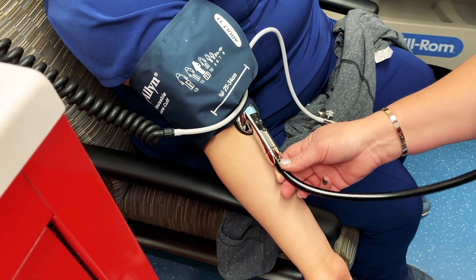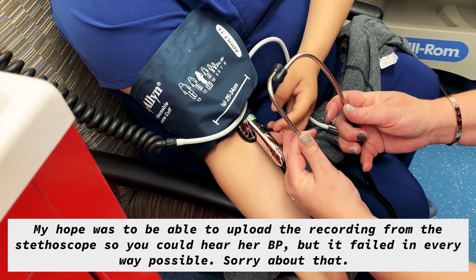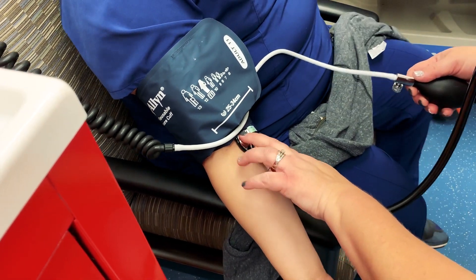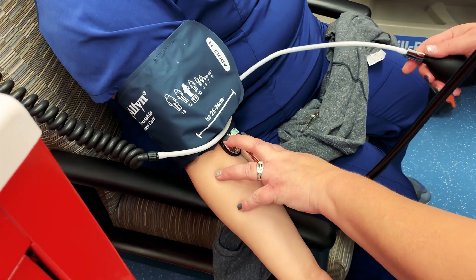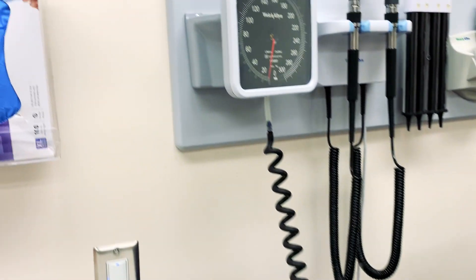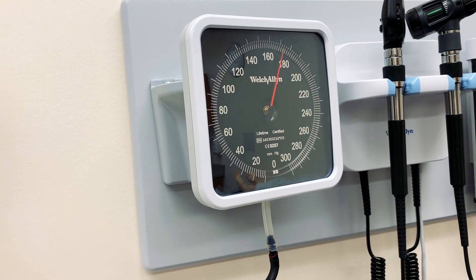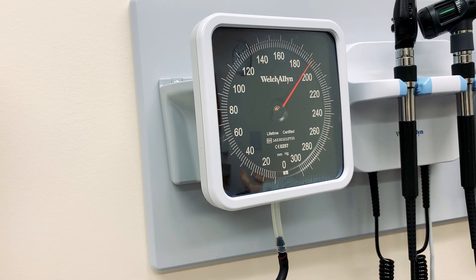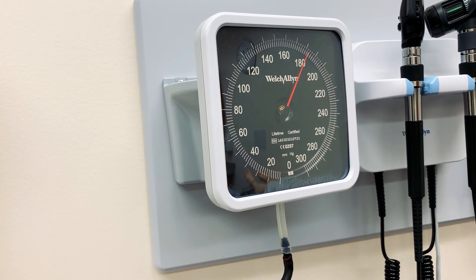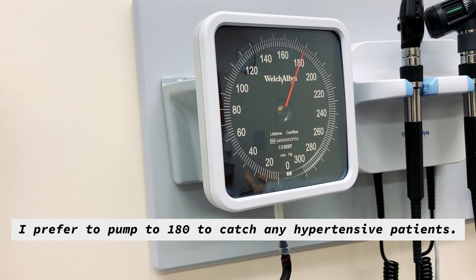You want to pump up to about 180 — maybe a little more, maybe a little less; I like to go about 180 to 190. Then you slowly start to let the air out.